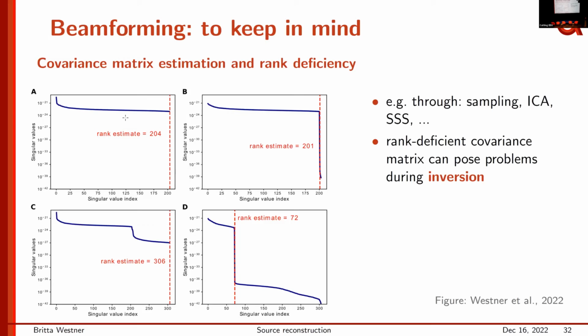First, at least all algorithms I have seen do not use a natural inversion, but a pseudo inverse of the data, which already helps with some of this. But then we can also use additional tricks. One trick is to regularize your covariance matrix.